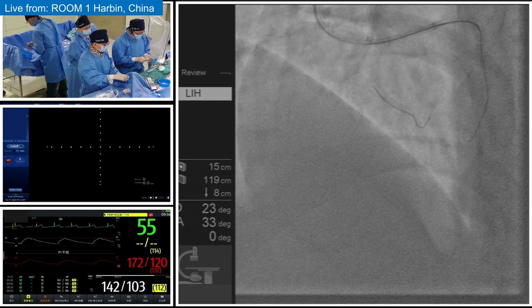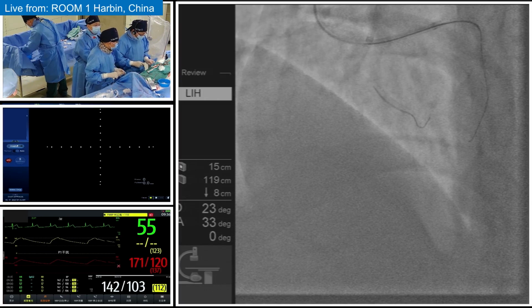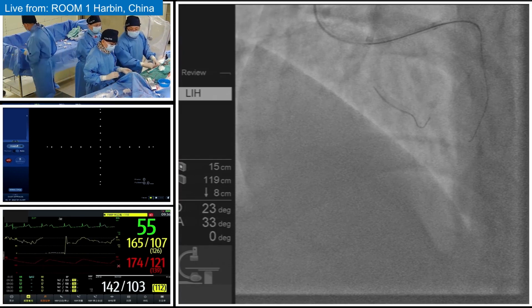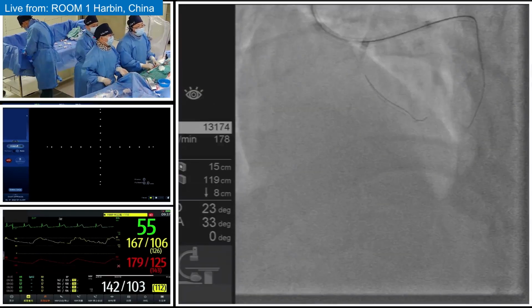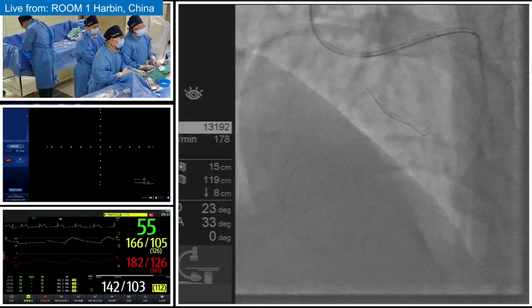So like Professor Lee introduced, we are switching to the retrograde approach. Since the antegrade stingray balloon-based ADR techniques don't have a clear view of the distal reentry site, due to the potential antegrade hematoma, and also we can see the antegrade parallel techniques don't make very good progress.